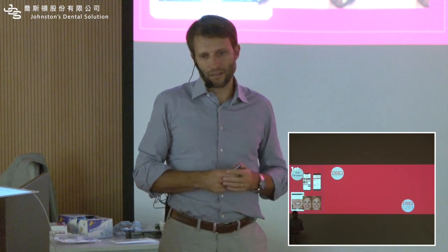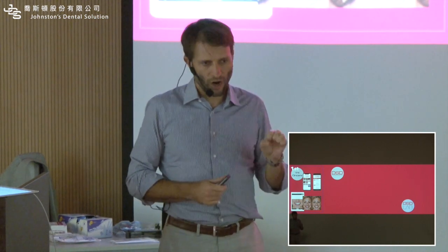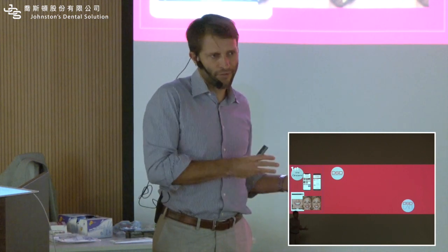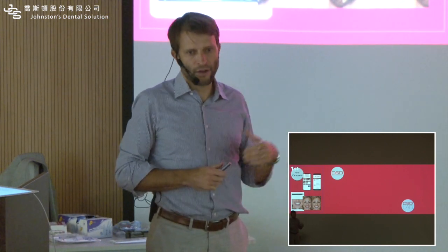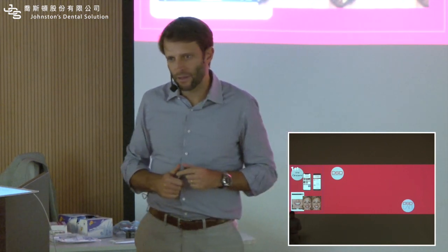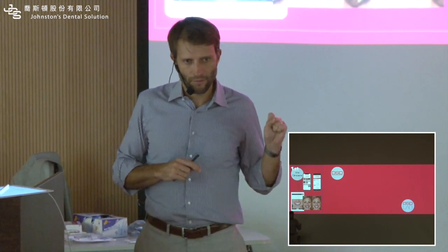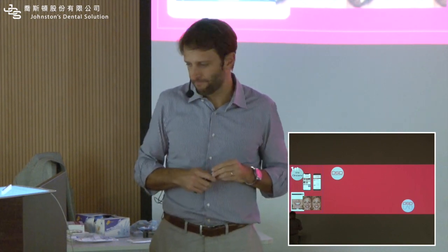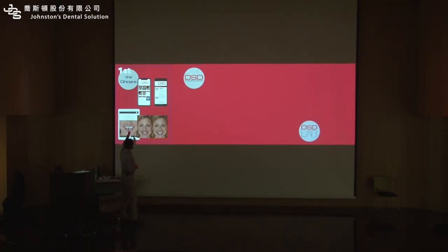Okay? You can ask us to print the mock-up for you, or you can have the files and print yourself if you have a printer, or if you know a lab here, the suggestion is get the files and print over here. Much faster and easier for you. But anyway, so let's pretend I documented the patient and I ordered the smile design.